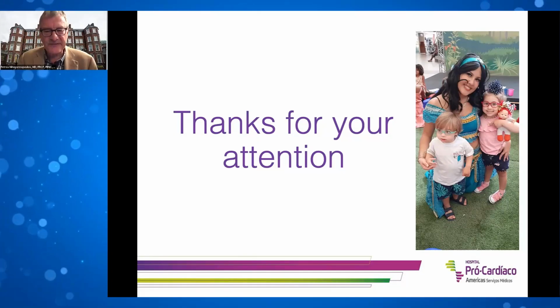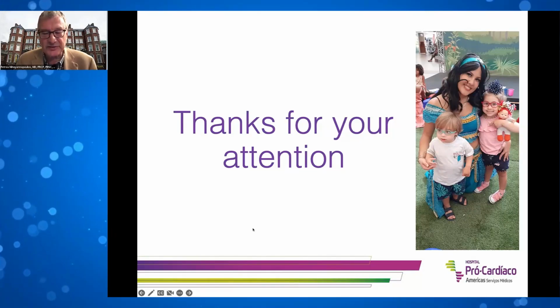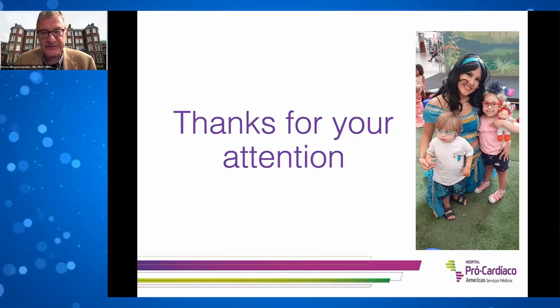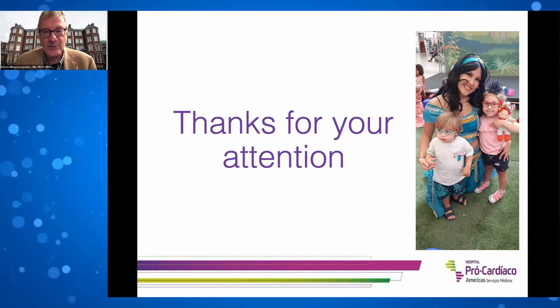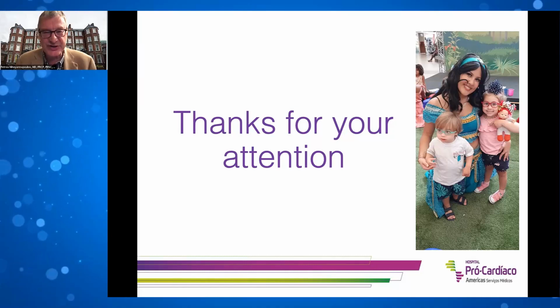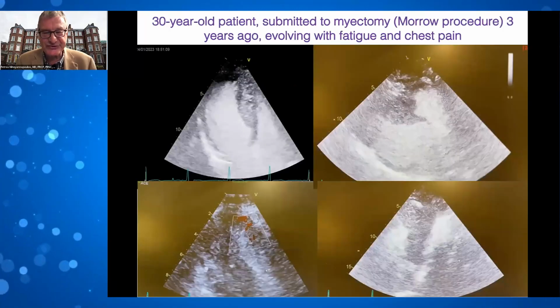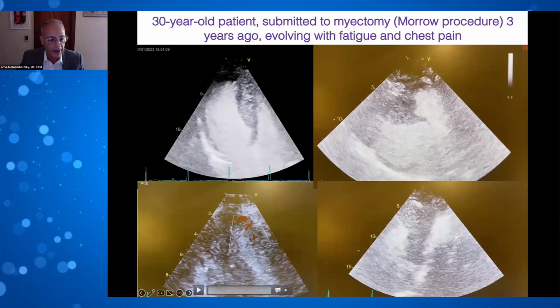While waiting, can I ask, in fact, amazing, very good presentation, Arnaldo. Some of the images you showed in hypertrophic cardiomyopathy comparing with MRI, I wasn't quite sure which are the contrast echo images and which are the MRI images. Quite impressive pictures. May I go back to the one previously shown comparing with MRI?